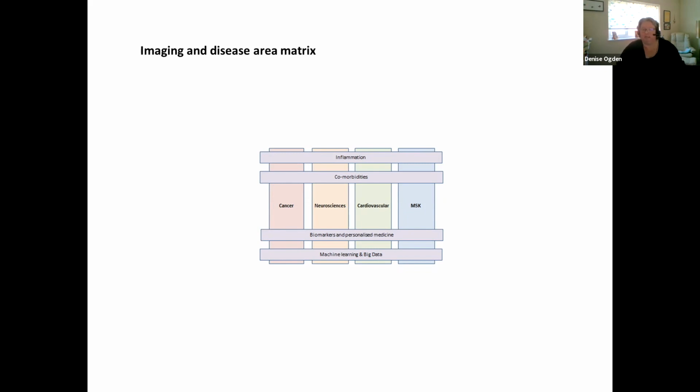There are ethical considerations, of course, with that, in terms of patients only coming for a clinical scan, so they need to understand that it could be used for research purposes, and also the logistical side of things, that the scan images can run into. I'm no technical member of staff, but they run into big gigabytes per scan. So we're talking about an awful lot of data there that we would need to think about having an infrastructure that could use.